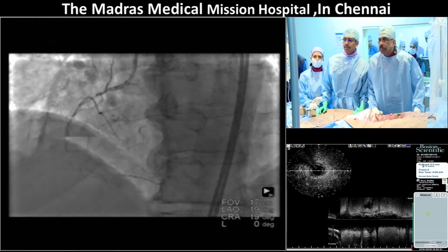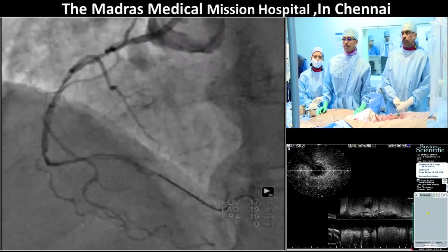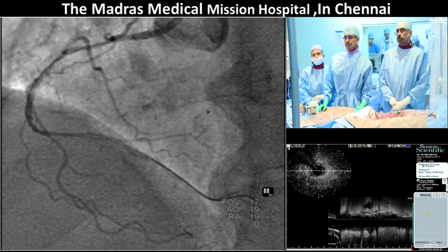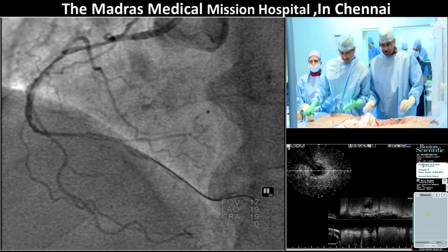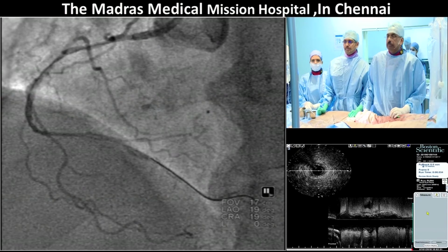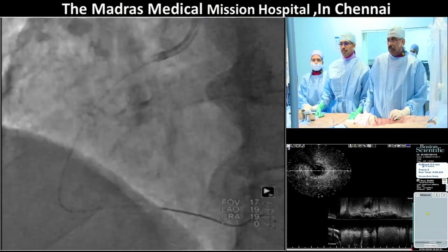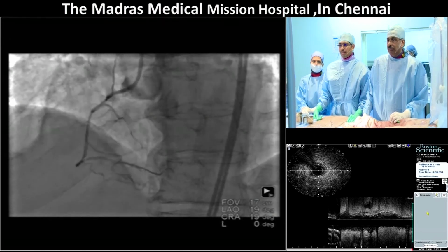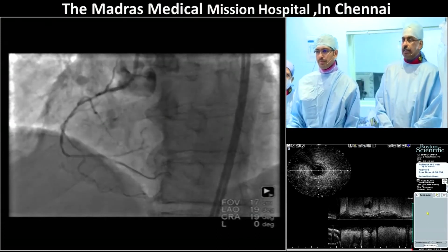No, because antegrade flow is quite okay, TIMI 3, and rather than meddling with that and worsening it, I would prefer just to stent the mid RCA and come out. Very small vessel though. Yeah, that's another reason why you don't need to chase that. Extremely small vessel. The reason the retrograde is not showing filling is because the antegrade flow has come up. It is TIMI 3. That is why your retrograde flow has come down. I think personally I would just fix the mid RCA. Fix the stents and then make a take.